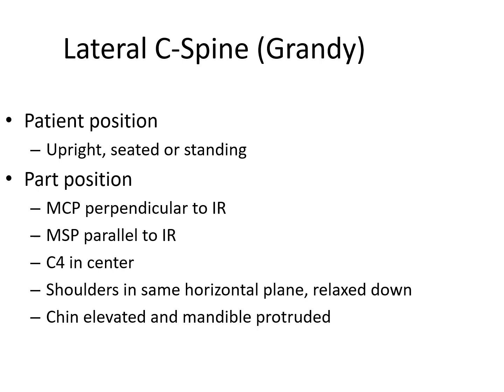Raise the chin up. You want to get the back of the mandible, which is called the mandibular ramus, the vertical portion. If you raise the chin, that swings forward of C1 and C2. If the patient has their chin tucked, then it's going to partially superimpose the anterior of C1 and C2. So raise the chin to move it out of the way of C1 and C2.